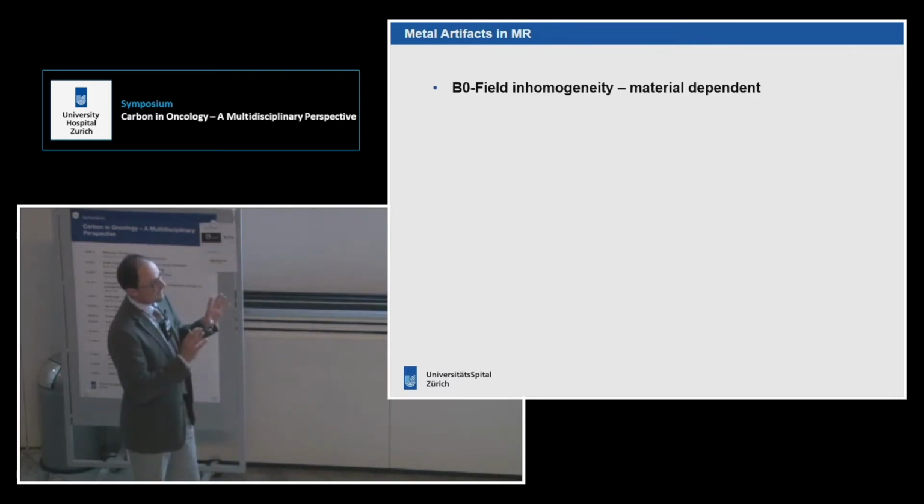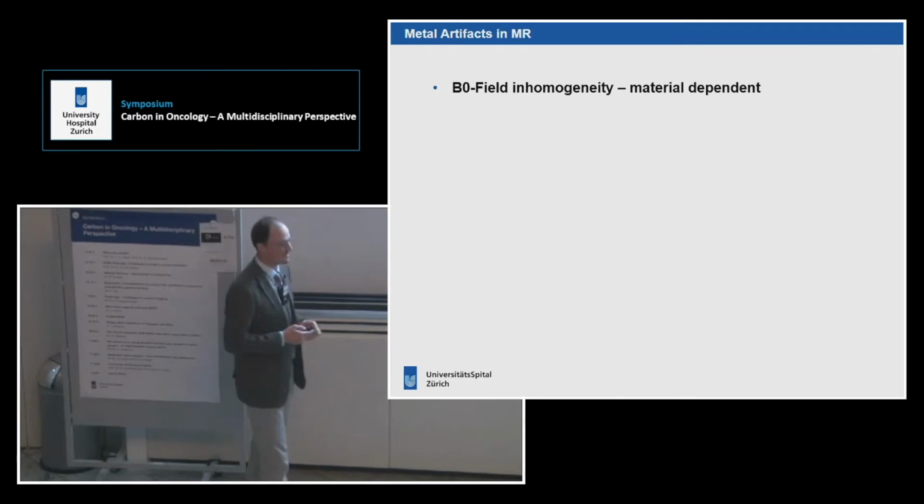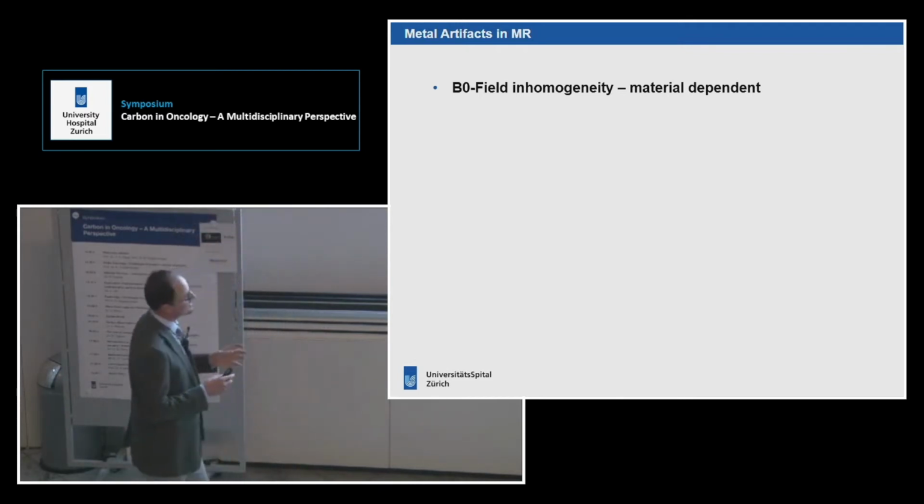So, having talked about CT, let's just have a quick look at MR, and I told you it's going to be a tough ride in 15 minutes going through all those artifacts in CT and MR. But MR is a different story.